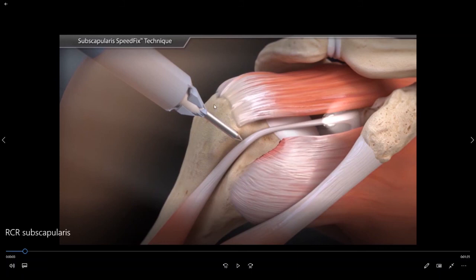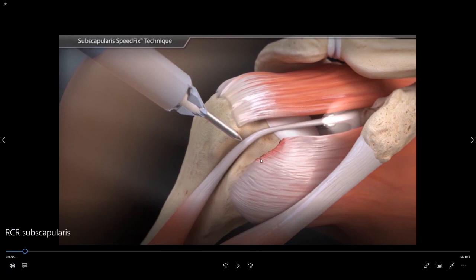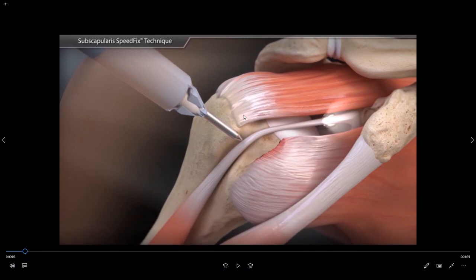However, on occasion we see more specifically tears of the tendon that goes in the front of the ball, coming from this muscle down here called the subscapularis tendon. Although it is possible to see isolated tears of the subscapularis tendon, as we see in this surgical animation, oftentimes tears of the subscapularis are associated with much larger tears that extend into the supraspinatus tendon as well. For the purposes of this video we are going to concentrate on fixing the subscapularis. Please refer to my video on general rotator cuff repairs if you would like to see a repair of the supraspinatus tendon.